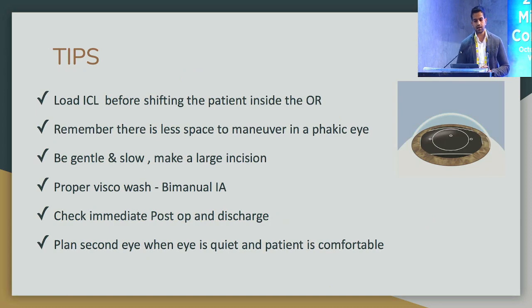So finally, tips. In the initial stages, or even now, I load the lens before shifting the patient into the OR. Loading takes some time, so be slow, be gentle, and remember there is very less space in the phakic eye, so be extremely soft with the lens. In the initial stages, make a very large incision, so it's easy for you to put the lens inside. Even if you have to take a suture, at least make a 3 to 3.2 millimeter incision.